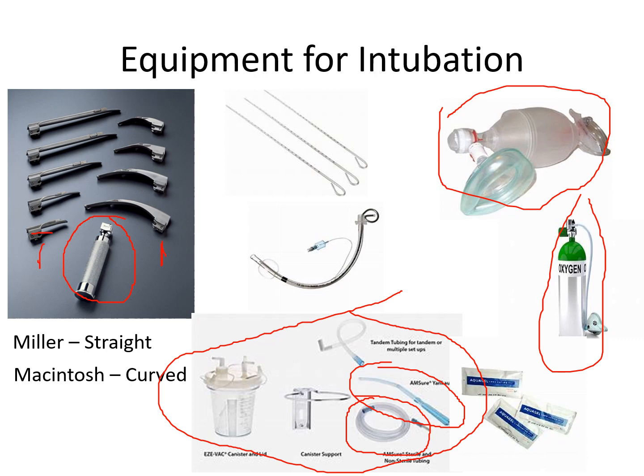Always make sure that the light is functioning. Once you attach the blade to the handle, you're going to snap it down and pull it up, and it will make sure that there's a light. If these are reusable ones, sometimes these light bulbs can become very loose and they can come off, so you'll always want to make sure that they are tight. Many laryngoscope blades are actually disposable, so once they're used, you can throw them out, but there are some that are reusable.